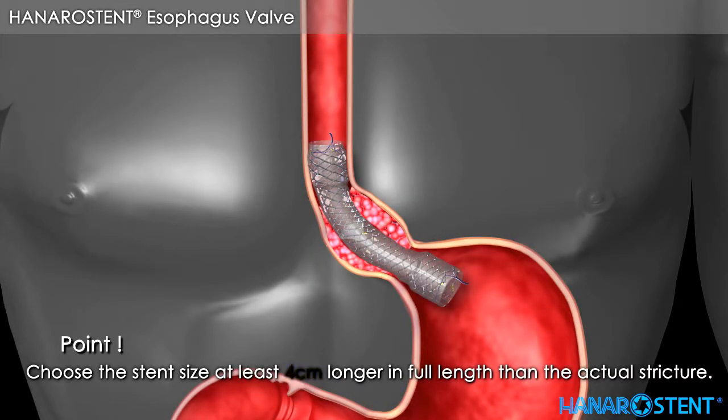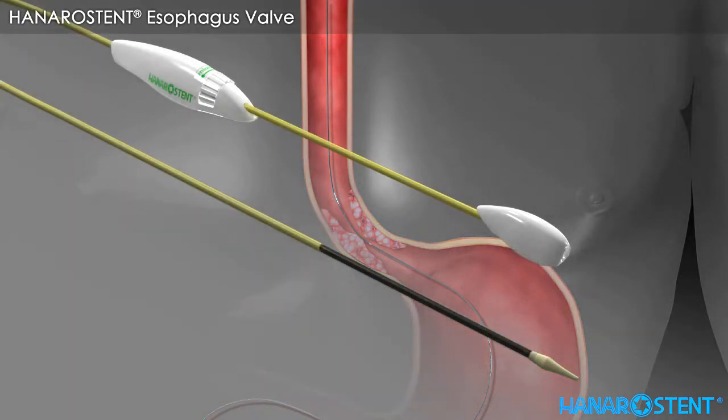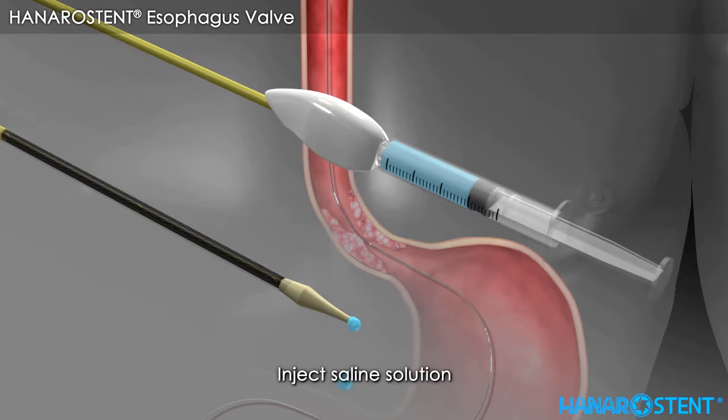Before introducing the stent, please choose a stent with a length at least 4 cm longer than the actual stricture. Take the delivery device out of the package and inject saline solution into the whole of the delivery device to make sure that the inner path of the delivery device is smooth and clear.